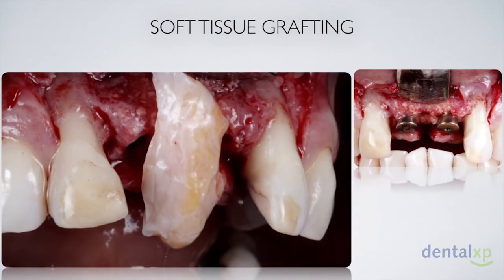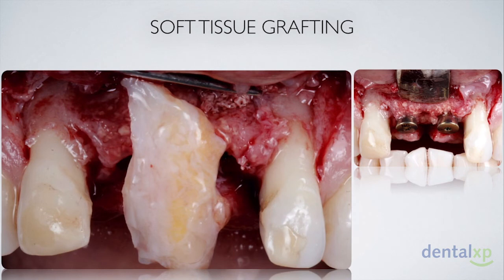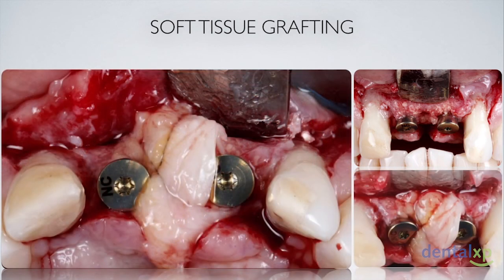And knowing that we're going to be faced with the risk of inadequate tissue height in between 2 papillae, we proceeded to augment the soft tissue with a connective tissue graft in this area, and this is to further enhance the restorative outcome or the aesthetic outcome of the inter-implant papilla. You could also see here that this graft was fixated with a crisscross periosteal suture to allow for adequate stabilization of this graft prior to suturing of the flap.